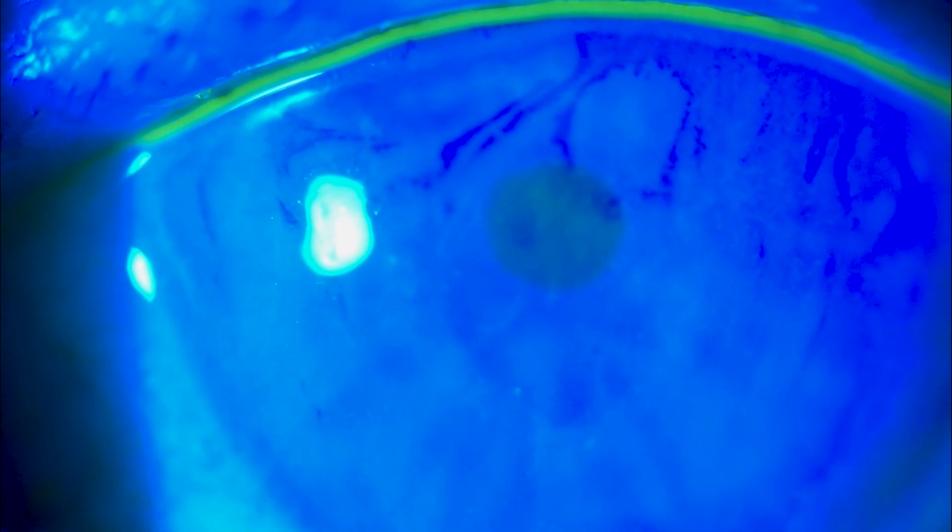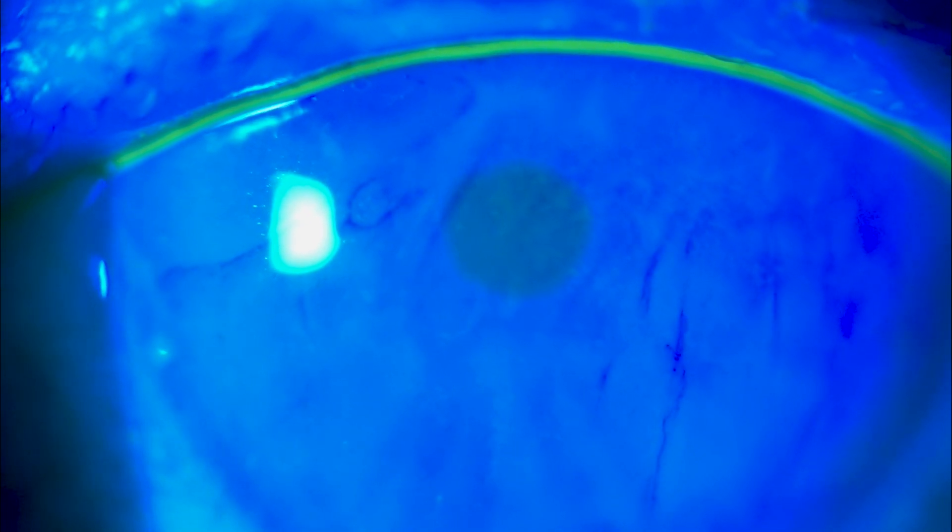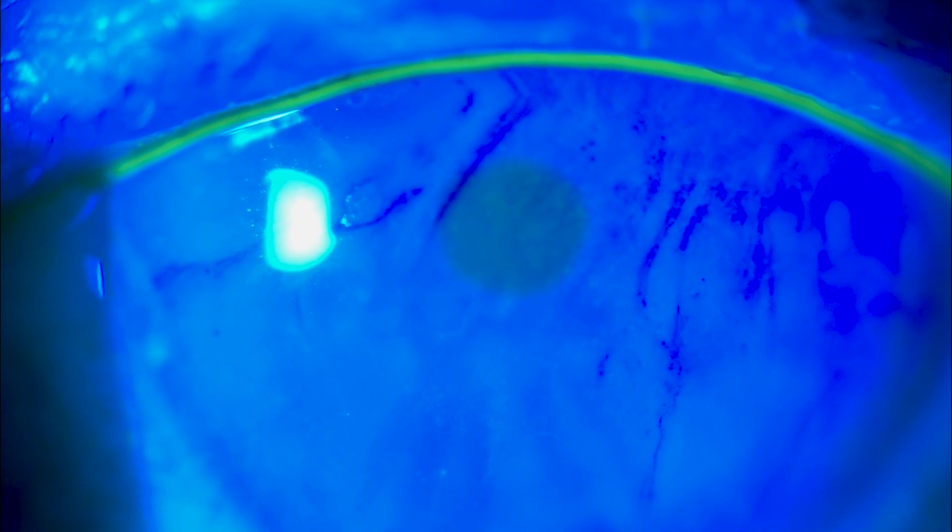Now, in a perfect tear film, when you blink, that tear film should hold for 10 to 15 seconds. In this patient, it's breaking down in 1 to 3 seconds, which is an indicating factor that she is lacking in the oil layer of her tear film.